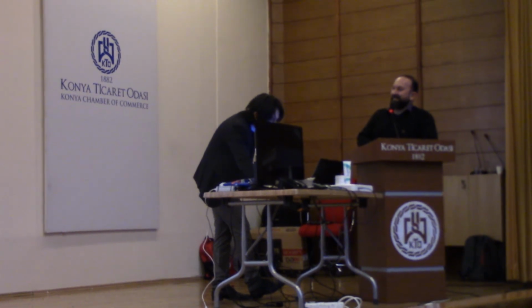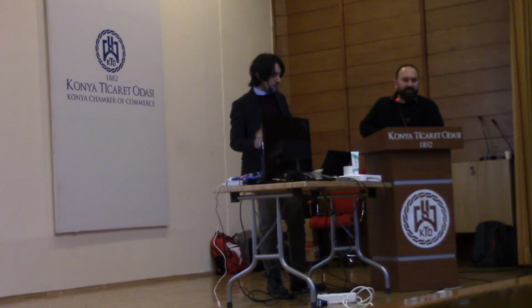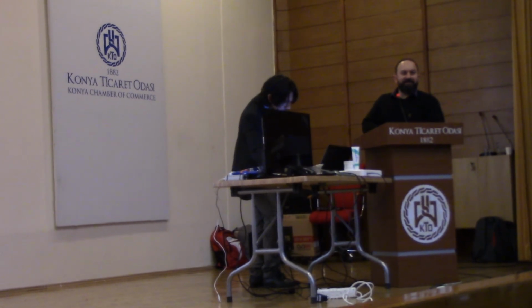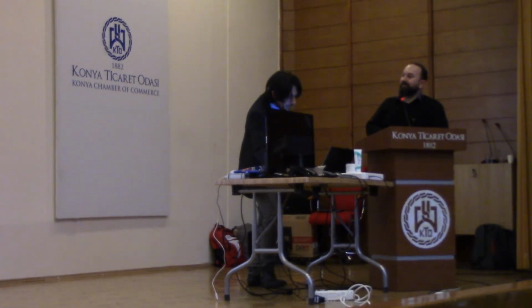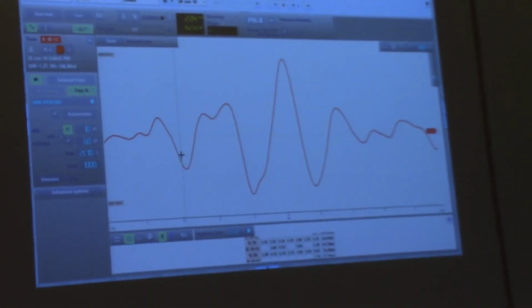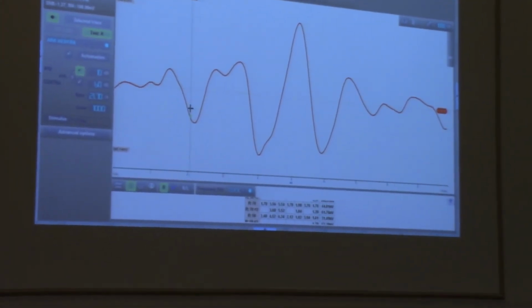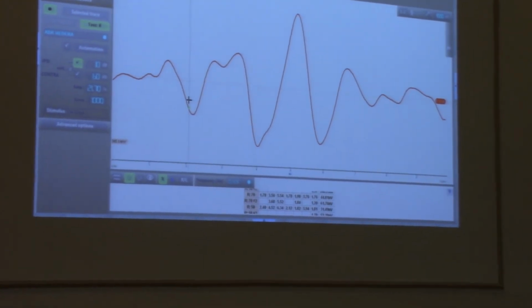So, any question on this part is very important. Also, it can happen to have, let's show this one. Sometimes the first peak is composed by two peaks that are close. Okay, here you can see something similar.